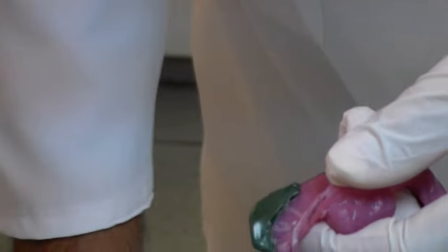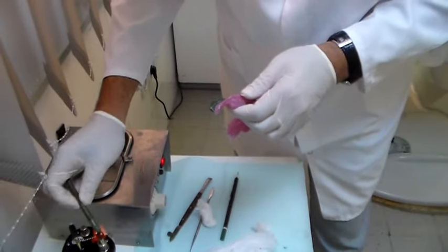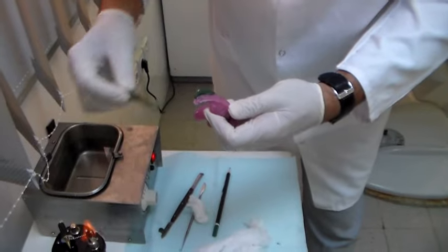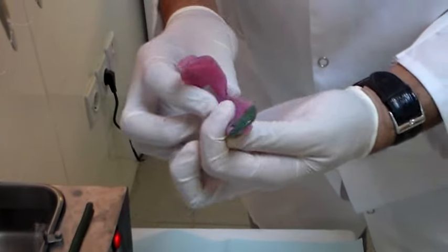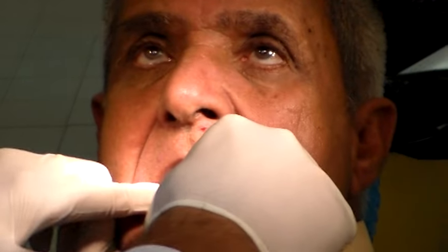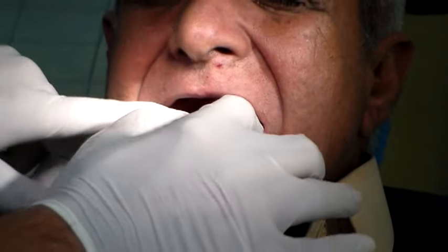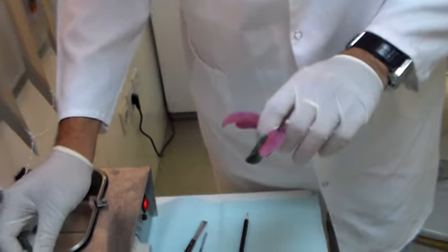I just molded my retromylohyoid region. I'm going to add a little material in the retromolar pad area. Sometimes when you cut it, it becomes sharp, so you want to scrape off a little bit so it's not sharp for the patient. Dry-flame the tip a little bit so it can bond to new material, then add material on the retromolar pad region, place it into the mouth, and just compress it. In this position I'm not making any tongue movement — I believe the retromolar pad will record by itself. Once done, take it out and check; you can see the pad form there very clearly.